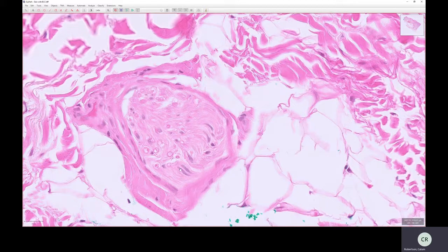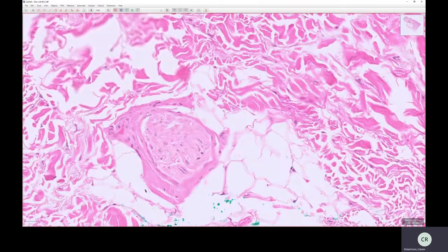Within the nerve, you can also see these nucleated cells. These are not the nuclei of neurons. We shouldn't really see them within a nerve. Within the nerve, you'll just see the axons. When you're in a tissue section, the neurons are elsewhere. But these are nucleated cells. These are viable cells, but they're not axons. They're not part of the neurons. These are Schwann cells. These cells are responsible for maintaining myelin, and that's what a nerve looks like.